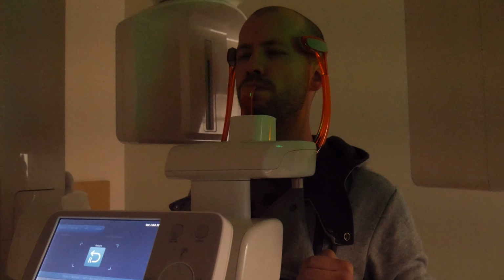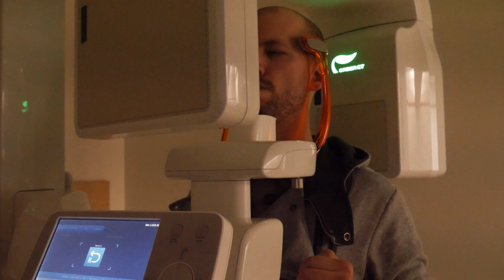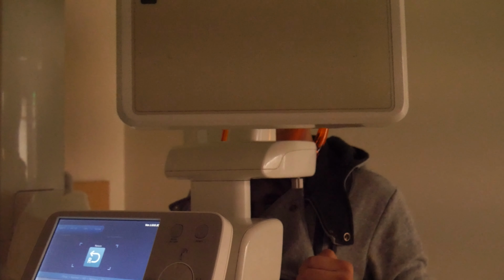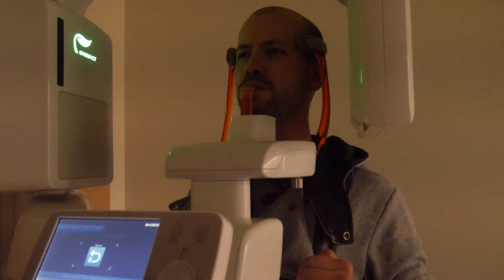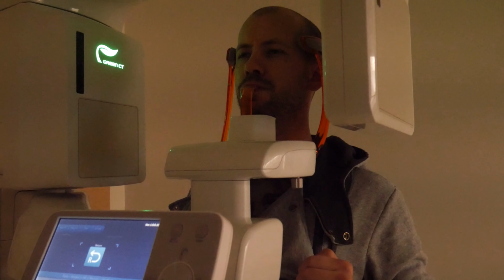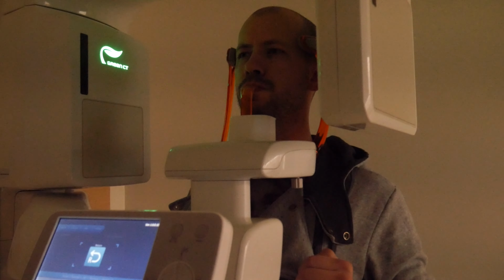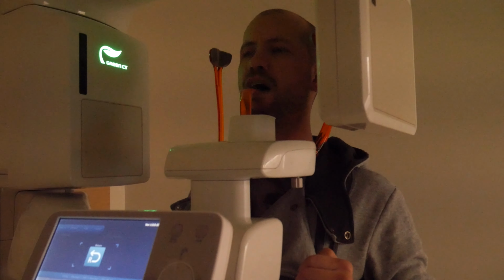Image capturing is complete. Please open your eyes and follow the operator's instructions. So we're just going to wait for it to stop moving, and then you can step out. Okay, you're good to step out.